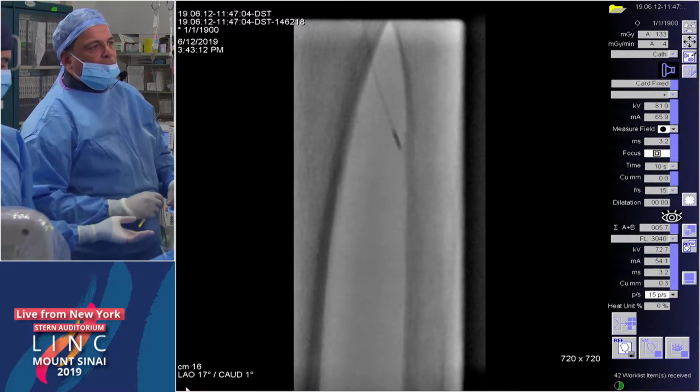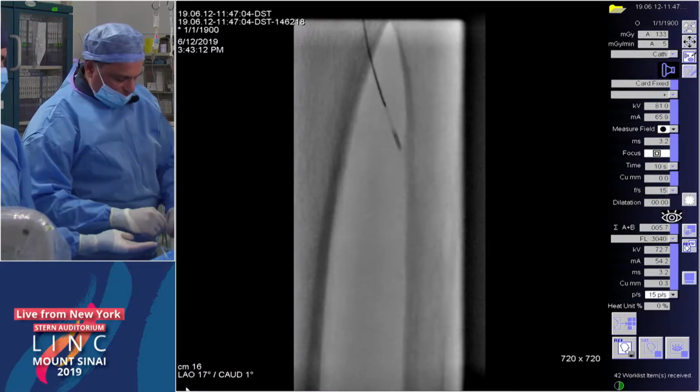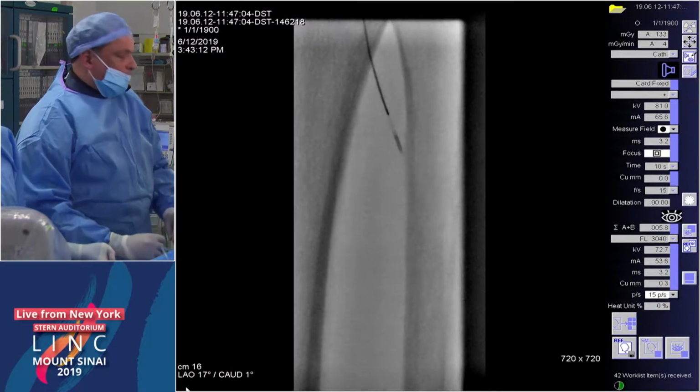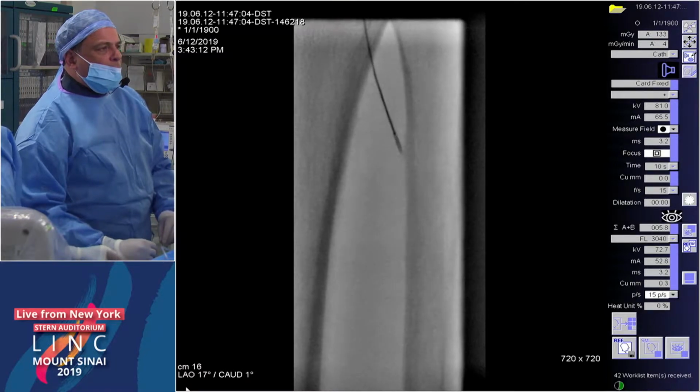So first of all, the antegrade approach is clearly the way to go here. You know, you're going to have to reach the foot. You've got a beautiful SFA proximally. This is a no-brainer for the antegrade, so we like that.